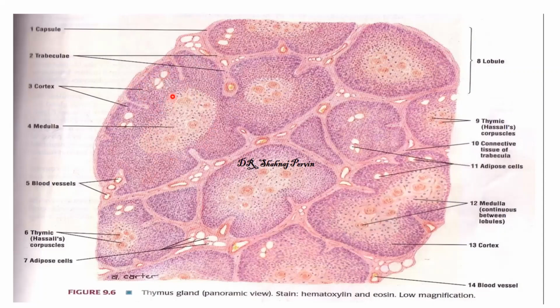So the thymic cortex contains the immature T lymphocyte, and the thymic medulla contains the matured T lymphocyte. And this is the aged thymus; after puberty, it has inside one nodule-like structure. Its name is the Hassall's corpuscle. So these are the structures of the thymus. If you are getting it, what is the histological structure? This is the histological section of a thymus. So how can you recognize it?